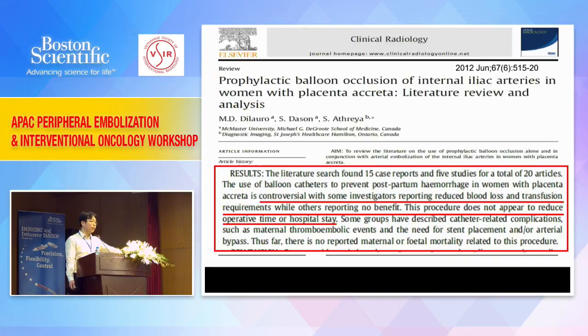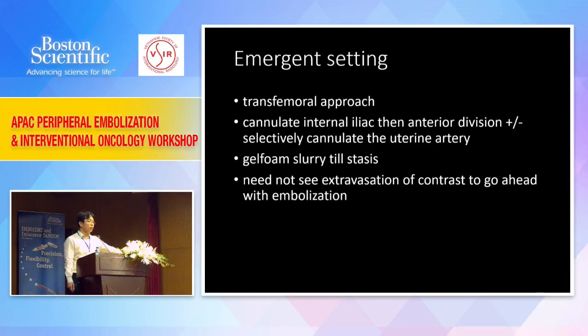Nonetheless, whether you want to place the balloon in the IIA can be controversial, with some investigators saying there's some benefit, and some others saying that it doesn't make much of a difference. So that's the elective part. That's when everything is controlled, everybody knows what's going on. But as you know, most of the time that doesn't happen.